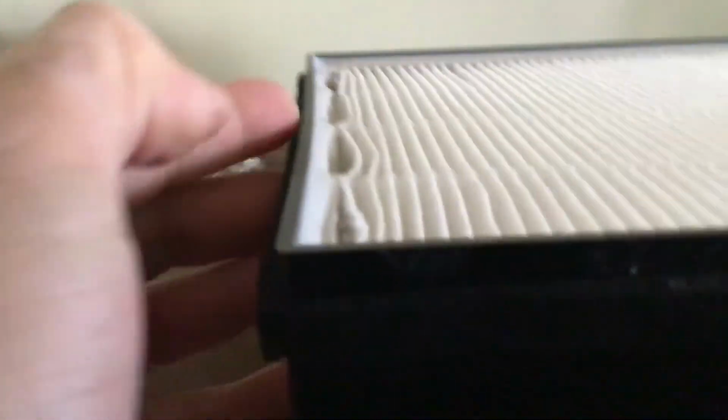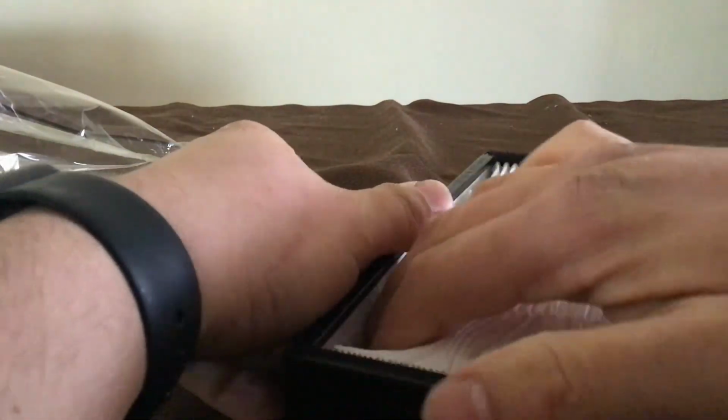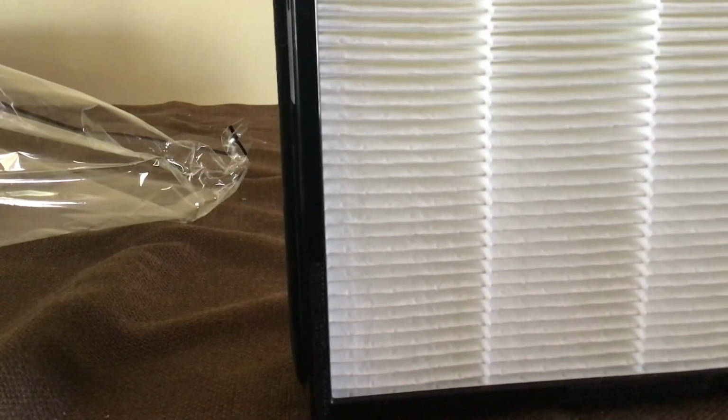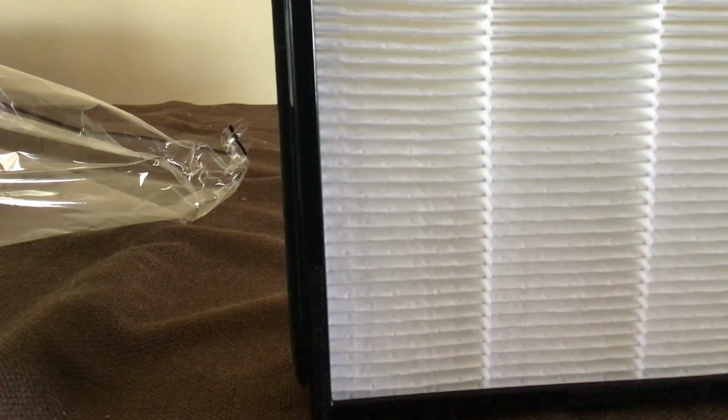In this particular case, this is actually kind of stuck, well, it's stuck to several things, but this is stuck in place with caulk of a sort, and so what we'll be doing is we'll actually be cutting the first pleat off if we can't get it out otherwise. Let's just see if we can pull it out enough to get the adhesive to give. Well, looks like that's a big fat no.